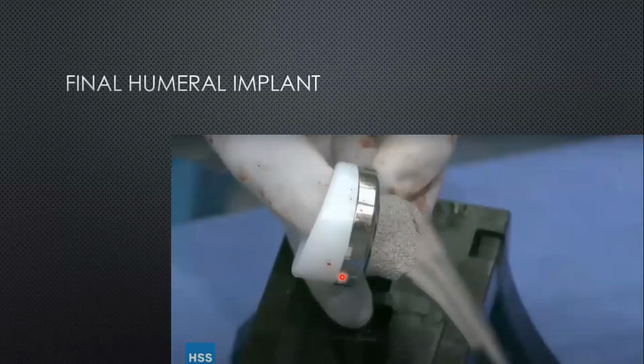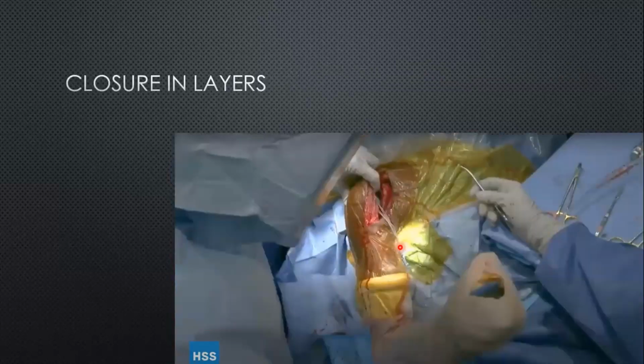And this is the humeral component, the final humeral component. You can see the onlay poly with a porous coating proximal humerus. And finally, closure after repair of rotator cuff.